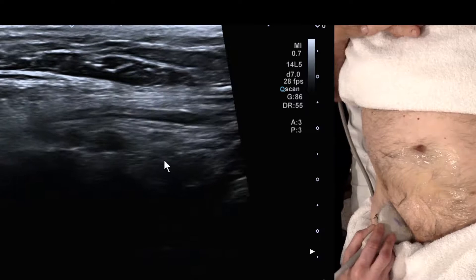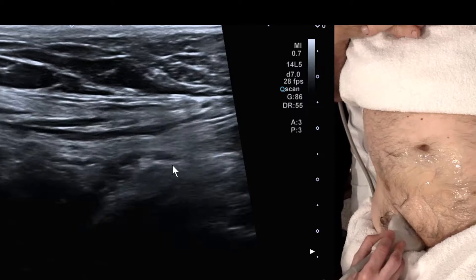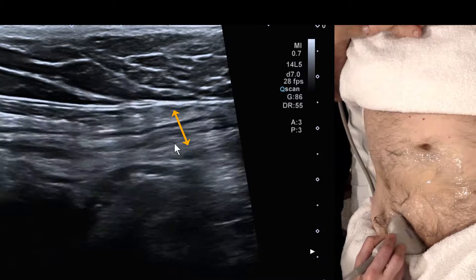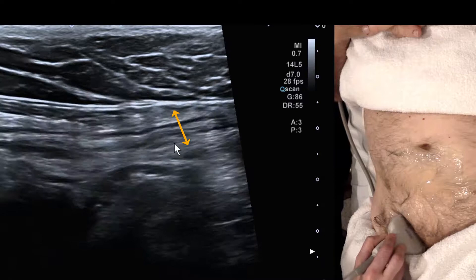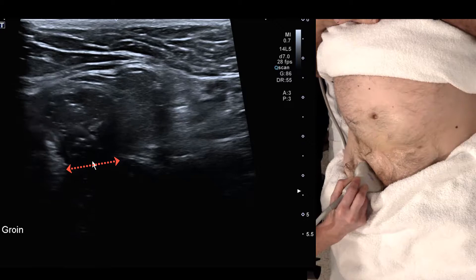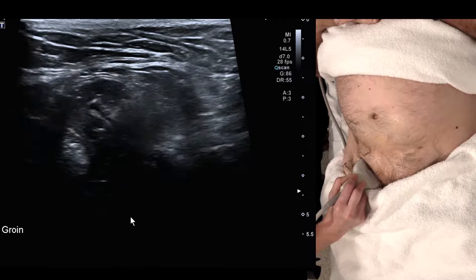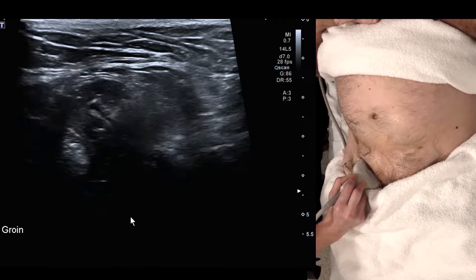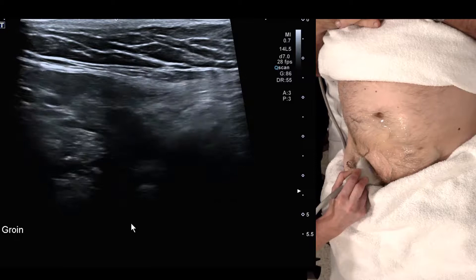The movement we saw was to the right of the screen, so we're going to come back to the superficial ring and look at the contents of the inguinal canal to decide if there's anything in addition to the spermatic cord. On a big push you can see this blunt-ended hernial sac coming into the inguinal canal from more posteriorly - there's a defect in the posterior wall. You can see it contains more than just fat - this component is fat, but this part is peristalsing.